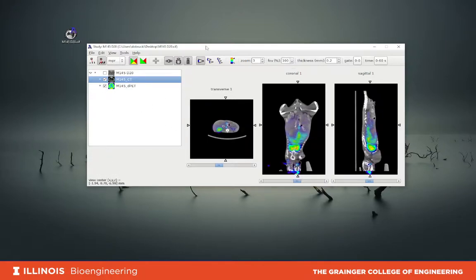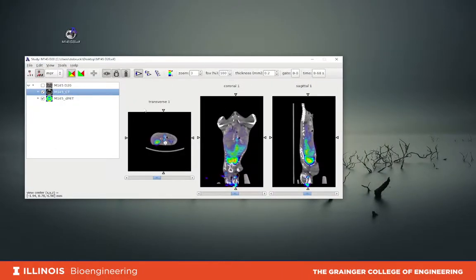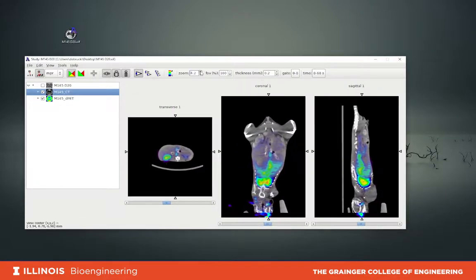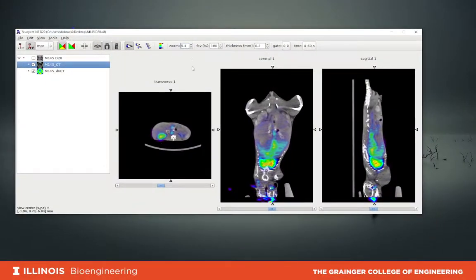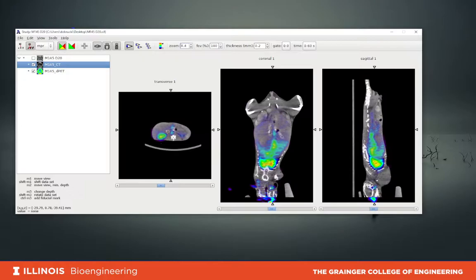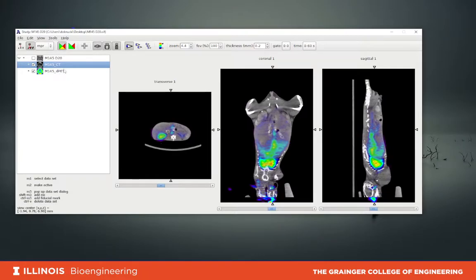What we'll be doing today is the analysis of the dynamic dataset. Let me first zoom in a little bit. I mentioned that we have a dynamic dataset — this is the PET dataset which contains 60 frames, one minute each. Right now we see just one frame.